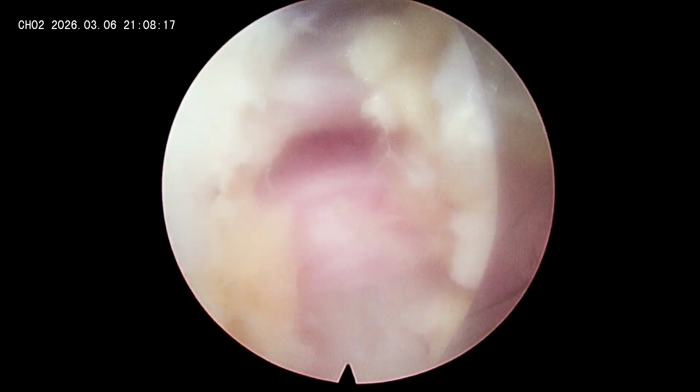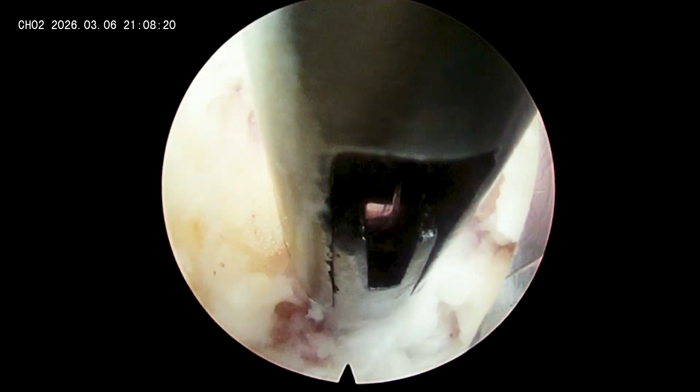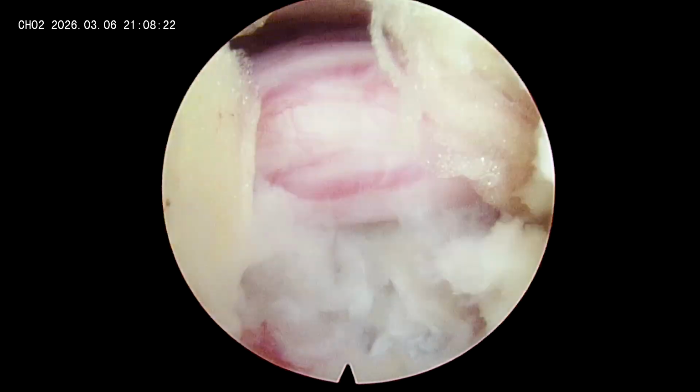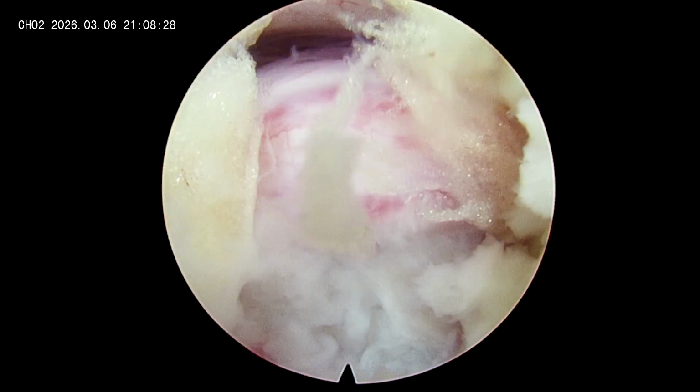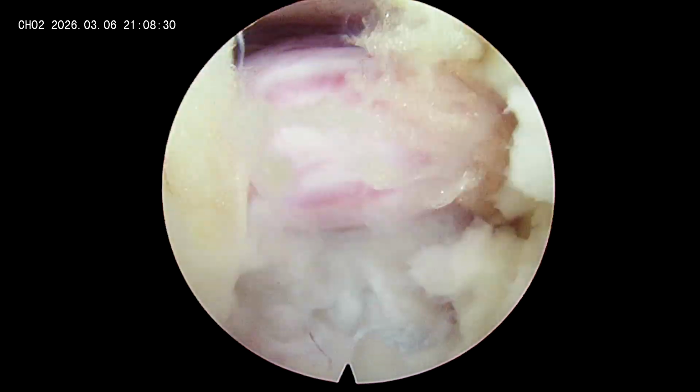At the end of the surgery, your root should be free. For that, you have to remove the sequestrated fragment and the annular hump. At the same time, you have to remove the free disc fragment from the disc to prevent recurrence of the symptoms.